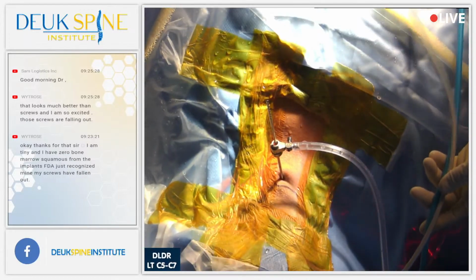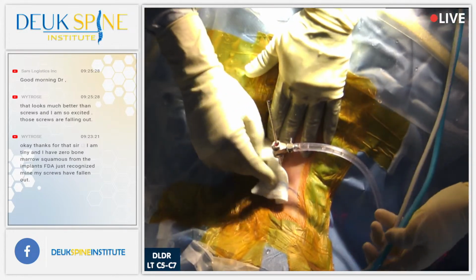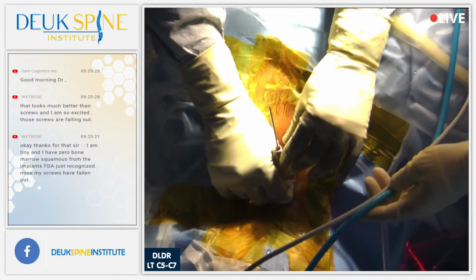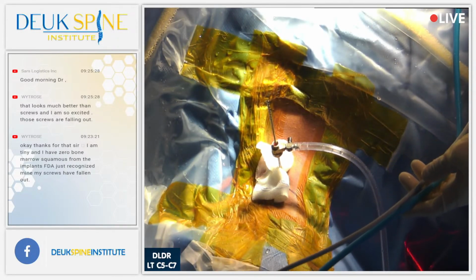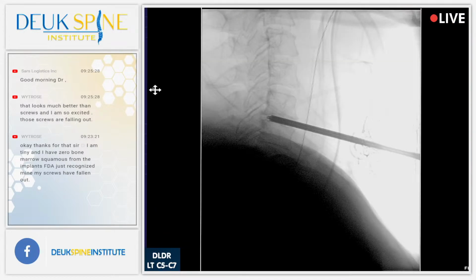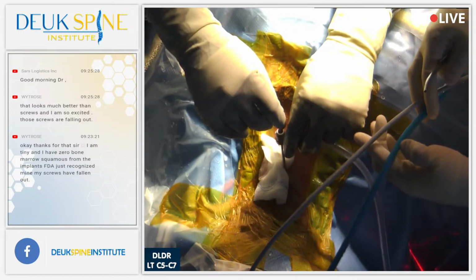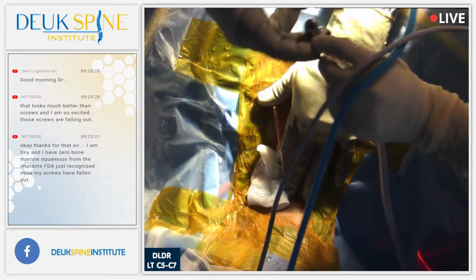All right, at this point, we've finished the 5-6 Deuk laser disc repair. We're going to move down to the next level, which is 6-7. But we need to get our x-ray machine, which is called a fluoroscope, in position. That's beautiful right there. Just keep it there. Everyone's got to do their part. We're going to need a little gentle traction on the shoulder, but not yet. First thing I'm going to do is take this tube out, and leave my dilator. So I put the dilator back, taking the tube out.